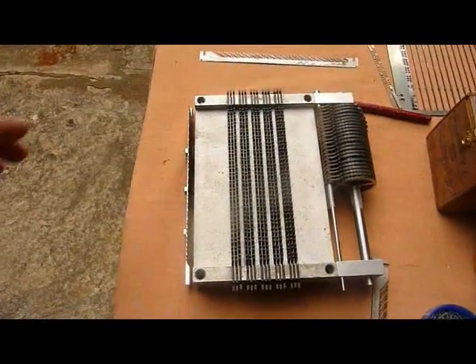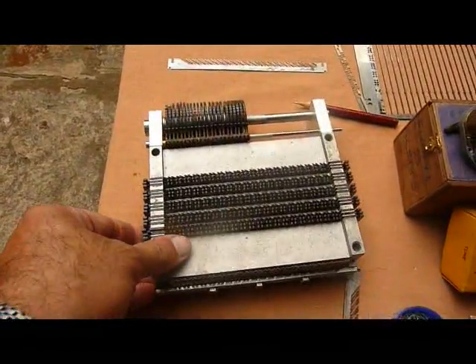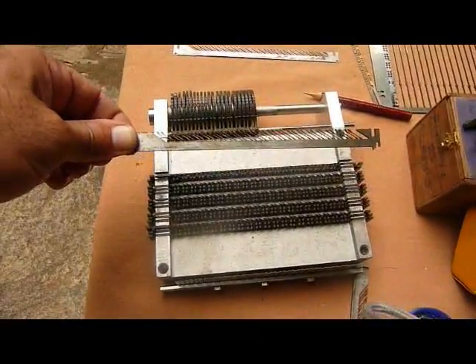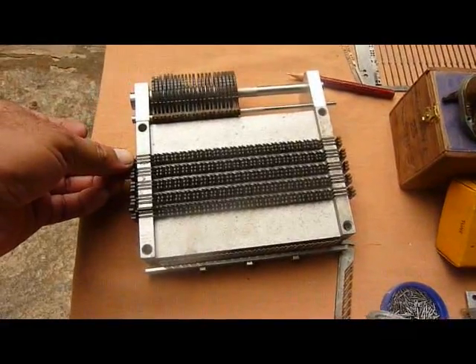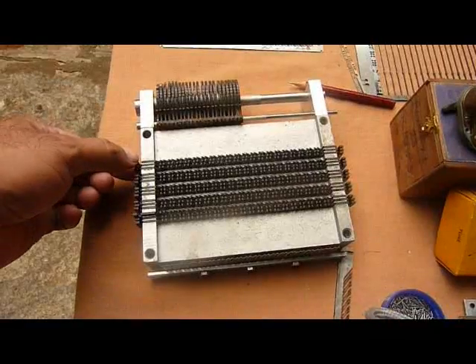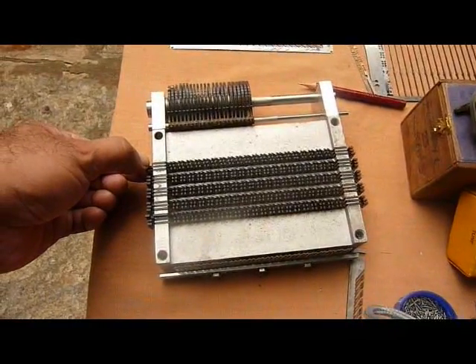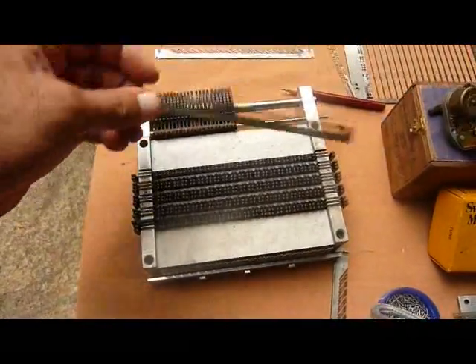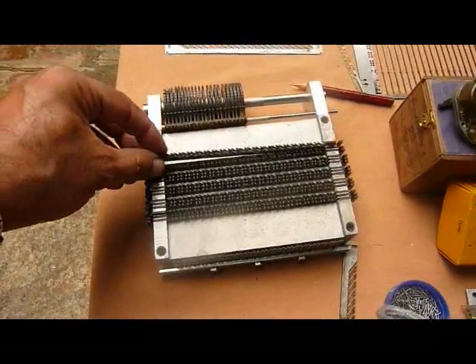In this image, I've taken off the plate with the pins and things, but you can see these correspond to the rows. Each of these slides is an actuator slide. They fit into slots on this base block, and they just move about a millimeter to the left or right. Moving one way pushes the pins up. Moving the other way returns to a non-actuating position. If the pins are locked, the spring lips just move down, bend and buckle under there into the space provided.